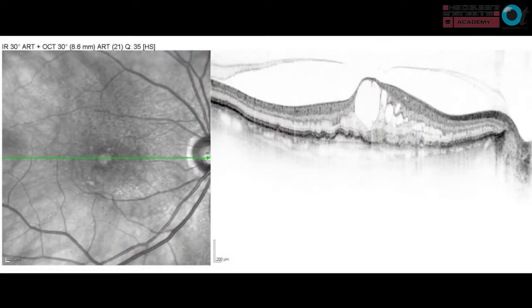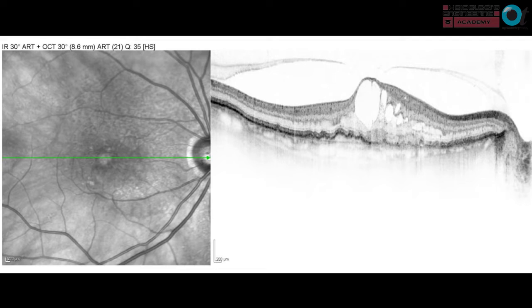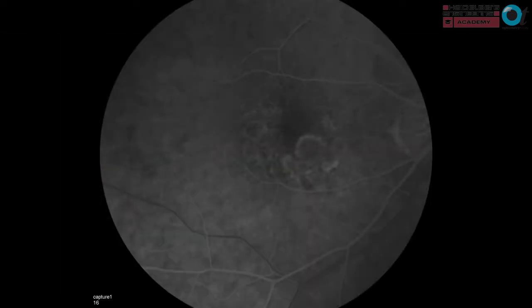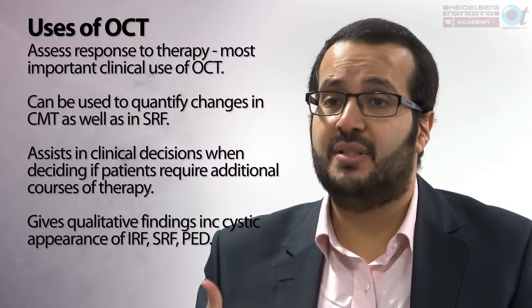With an elderly gentleman with geographic atrophy in the left eye now noticing distortion in the right eye with macular edema and other signs of AMD, wet AMD must be the top priority — that patient needs to be fast-tracked to clinic. A fluorescein angiogram in the earliest venous phase shows the choroidal neovascular network lighting up. OCT is also used in the hospital service to monitor response to therapy — changes in macular thickness, subretinal fluid, cystic appearances of intraretinal fluid, and pigment epithelial detachment — helping to make clinical decisions about additional courses of therapy.